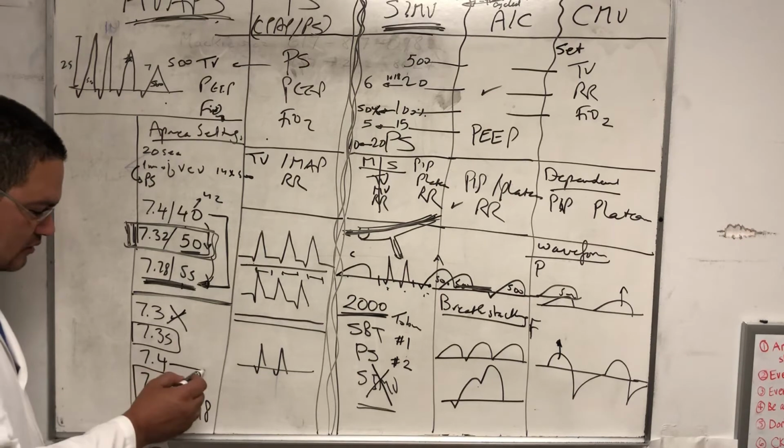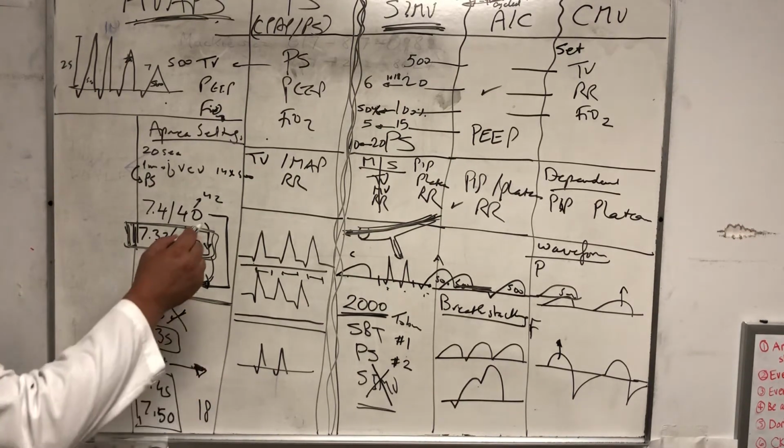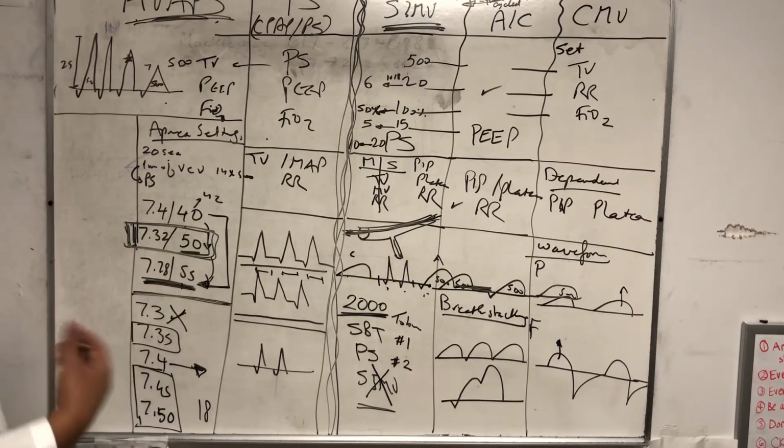And then this one is not bad. The 7.4 is not bad, but of course you have to think about it in these terms. The patient has to go through every SBT, and we'll wait a long time for him to breathe. So it'll be not practical. And also, I want the patient to be on their toes all the time, always breathing above the vent. If he's 7.4, he might not breathe above the vent, right? So we always have to maintain the 7.35. And that is it.